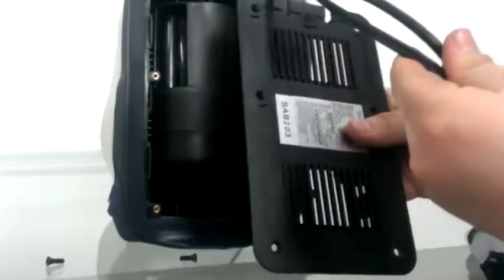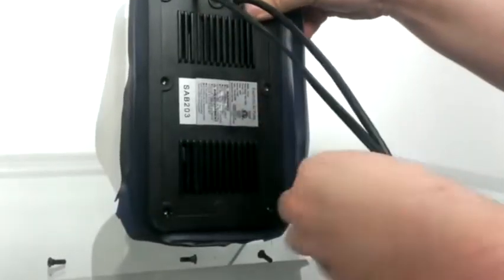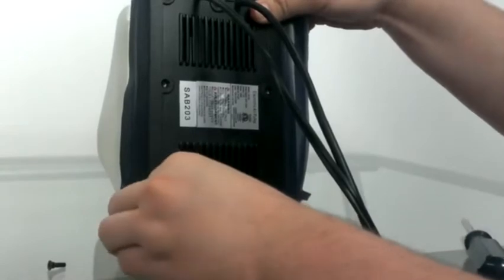Take the faceplate and put it back on, lining up those two channels on the side with the cords. That will snap back into place, and then all you need to do is put those six screws back in, and you're ready to go.